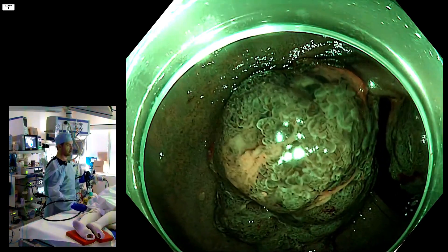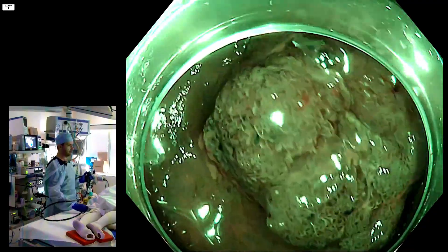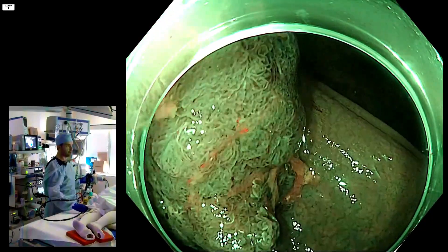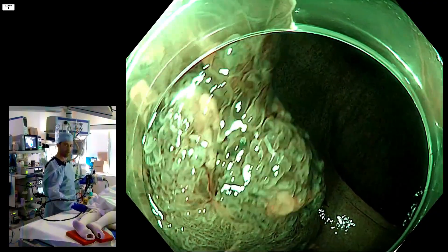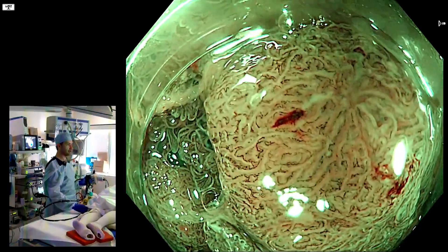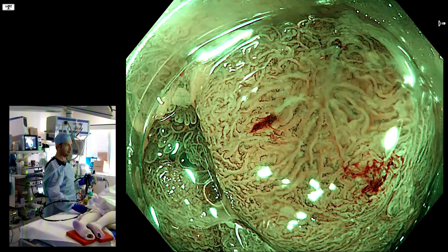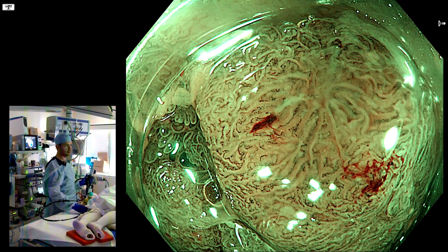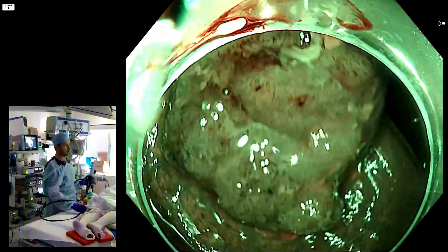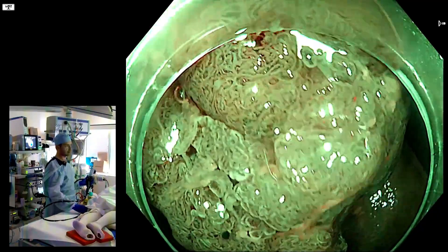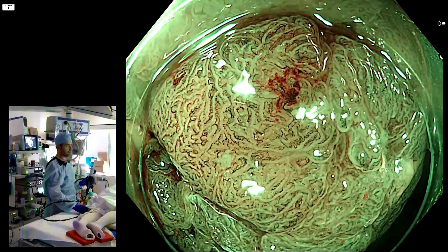I won't turn off the virtual chromoendoscopy. Let's focus on this other polyp. We're looking for the area that's most disordered — a really important concept when you're looking at polyps. There is no point in analyzing a beautifully regular structured part of a polyp if the part behind it is irregular. Let's zoom in and go more near focus. The cap is useful just to sort out the distance. You can say that this is pretty regular, although potentially some irregularity is creeping into the blood vessel pattern — it's certainly not totally disordered. You would be forgiven for calling that completely regular, J-Net 2A, or losing a bit of structure with some increased caliber of the vessels, J-Net 2B.